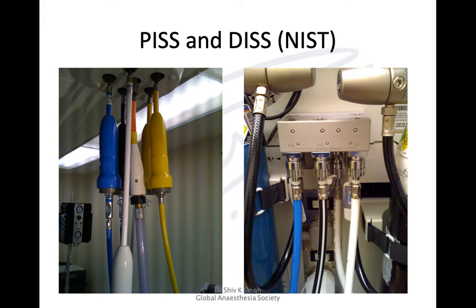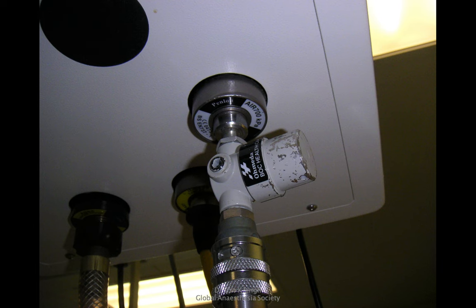At the back of the machine we have NIST — Non-Interchangeable Screw Threads — also known as the Diameter Index Safety System. We also see the Pin Index Safety System at the back of the machine for the cylinders.